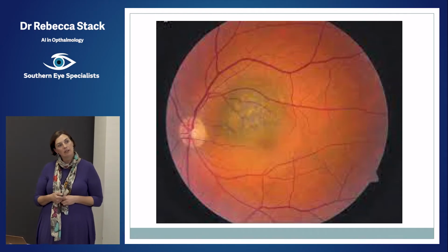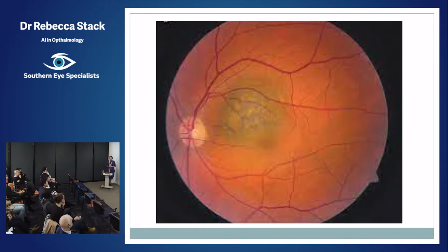What's this? More ROP. Any takers? No? It's a choroidal neovascular membrane.